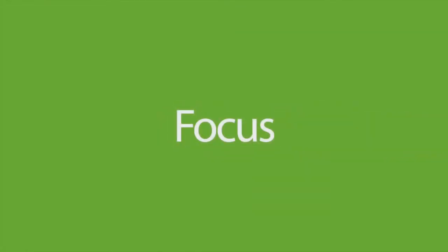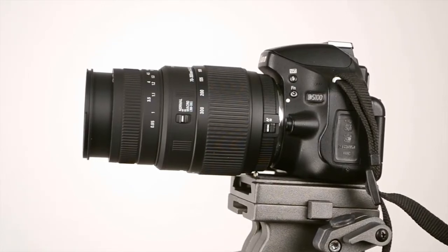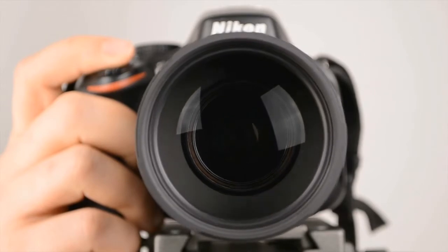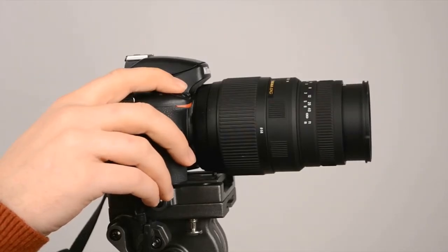First, make sure your photo is in focus. If you're using a point-and-shoot or DSLR camera, autofocus by holding the shutter release button halfway down for a second before taking the photo. Most cameras will beep when they're ready.